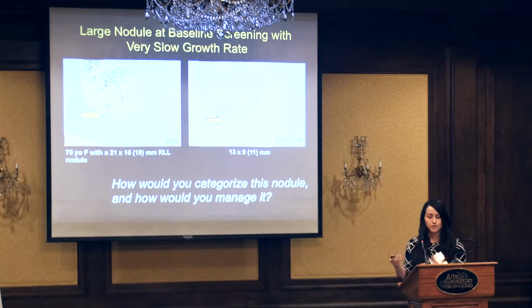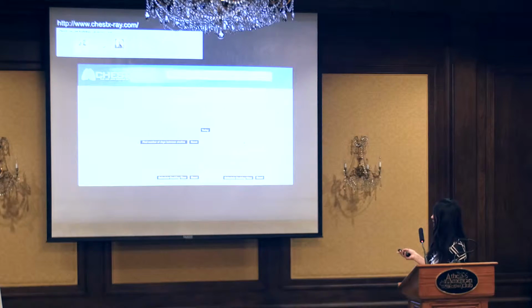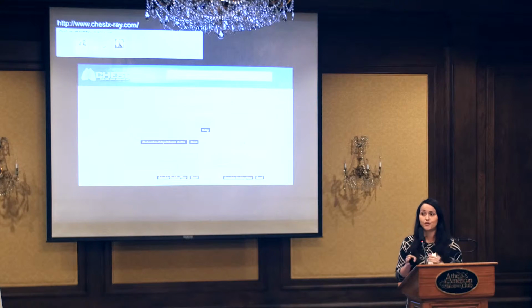And once you print your table and start looking at Lung-RADS, it really doesn't address things that were there before the baseline screen, actually. It just doesn't talk about it. So you're kind of stuck with that.